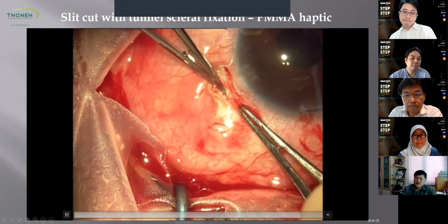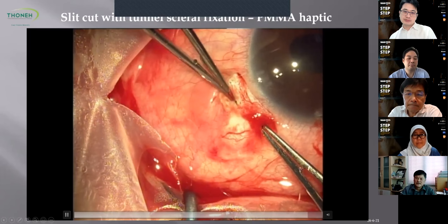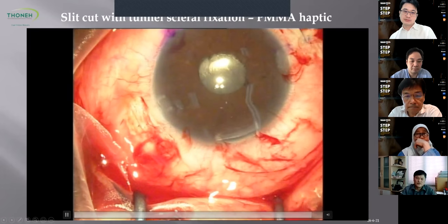You can either suture this slit wound or you can just leave the slit wound like this. The lens is actually very stable. I have cases that are done more than 10 years without any problem.